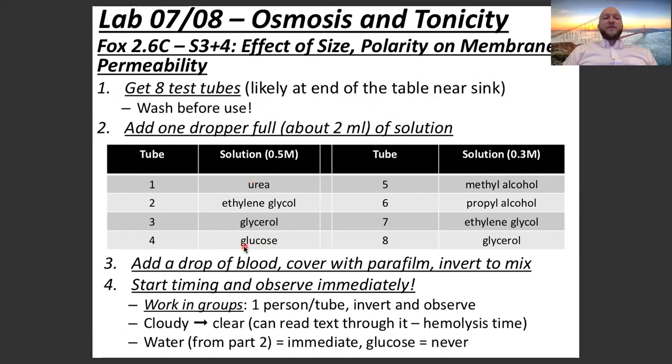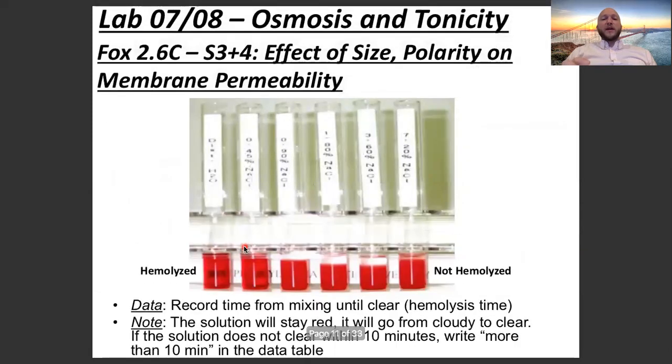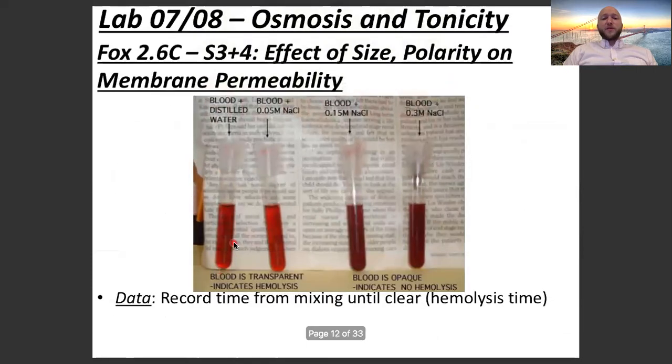After we do this, we're not going to look at it underneath a microscope. After we put the drop of blood in, the solution is going to be kind of dark. We're not going to be able to see through it.